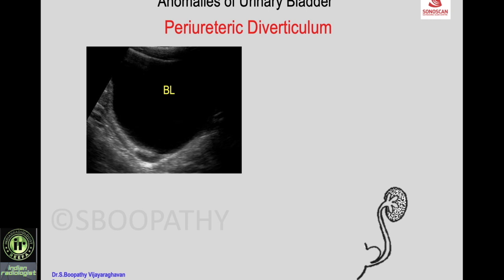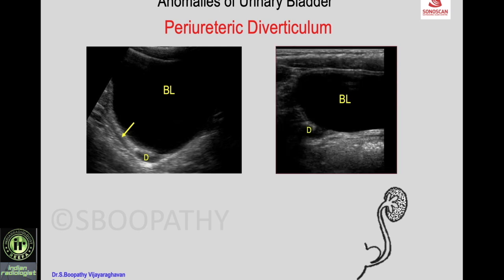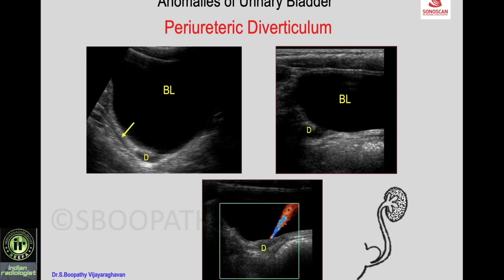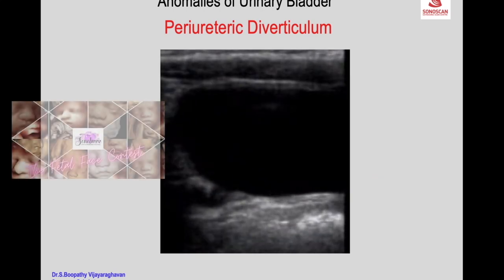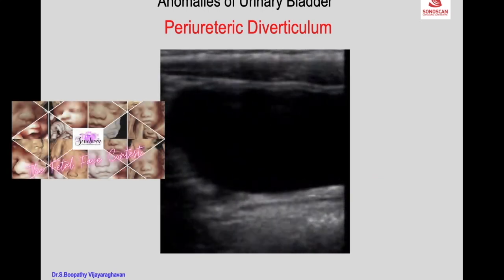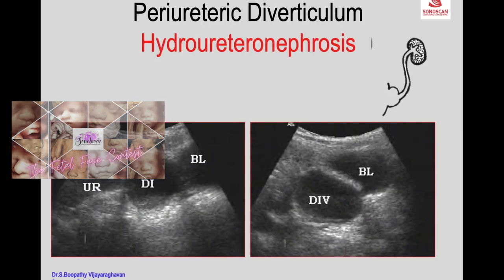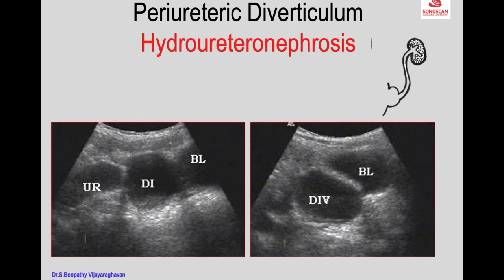In the periureteric diverticulum, you see the bladder and lower ureter with a diverticulum close to the ureterovesical junction. On transverse scan, the diverticulum is distended, and color Doppler shows the ureteric jet very close to the diverticulum, confirming it is a periureteric diverticulum. A video demonstrates distension and emptying of the periureteric diverticulum, which can also cause obstruction to the ureter.